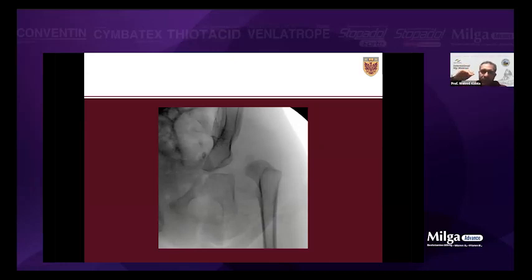Actually, at this dissection, I use retractors. I put two right angle retractors, one to retract the sartorius medially, and the other to retract the TFL, or tensor fascia lata, laterally. This would be enough to give you the interval dissection. You'll see some fat. If you go a little bit deeper with your retractor, you'll see the rectus muscle.